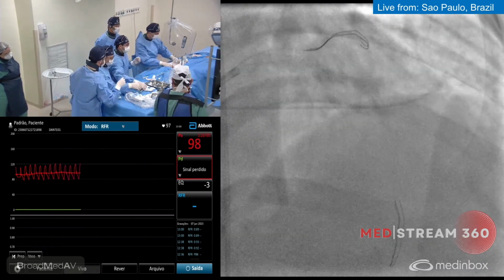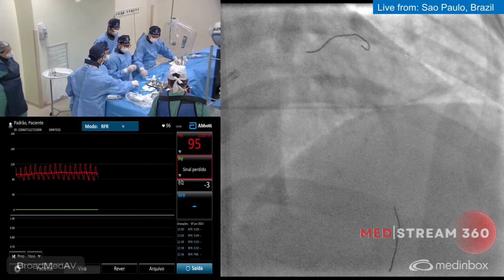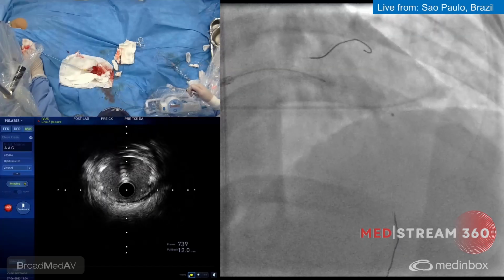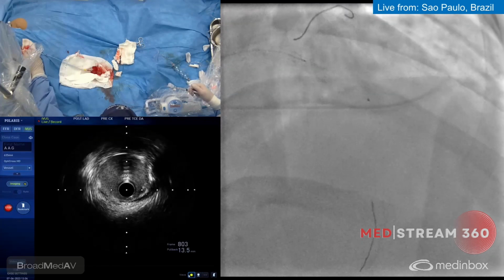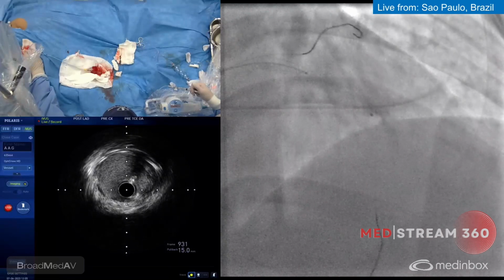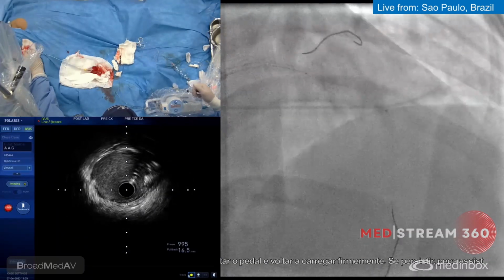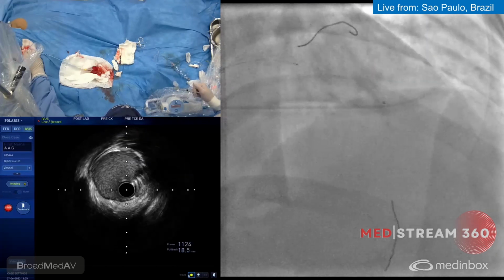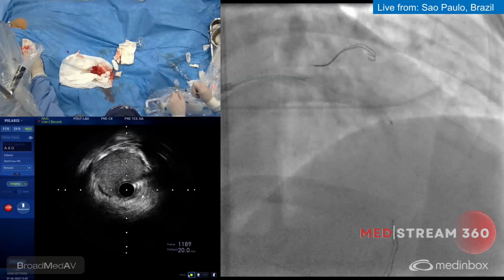We are going to be distal to the stent to see the ostial left main. Ricardo is bringing the IVUS now. So we see it fully open according to the vessel size. We optimized here with a 3.5 by 20 stent, and went up to 20 atmospheres. Great, the stent is well expanded.